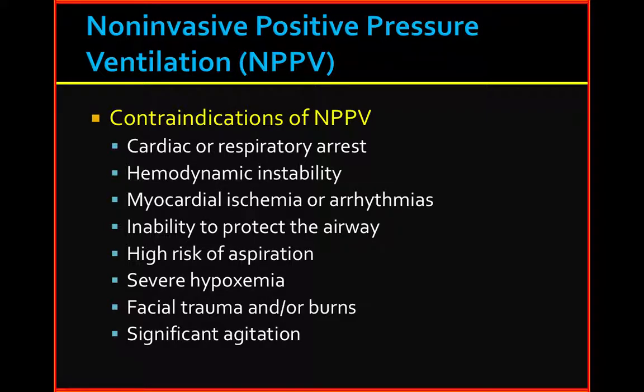That's about 500 cc's tidal volume, breathing at rest, which is about 7 cc's per kilogram. So that's kind of the one standard number if you're in the hospital. Keep that in your back pocket. Using these numbers, you can adjust the tidal volume up or down based upon height until you have time to cross-check by formula or table.